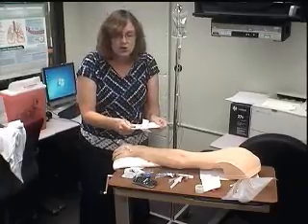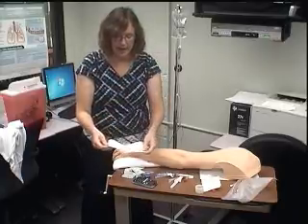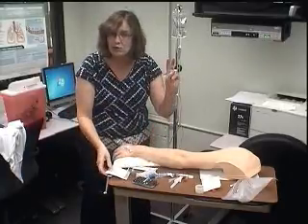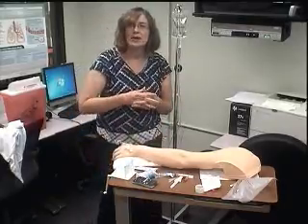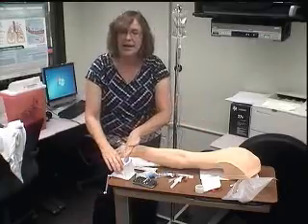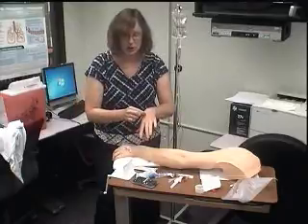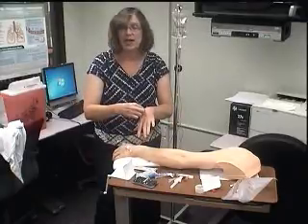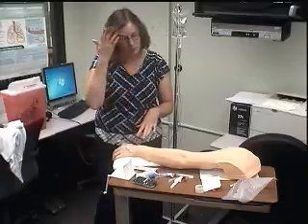2x2. Guys, just like you learn in fundamentals, when you open packages, you open using a sterile technique. I know that this is not a sterile procedure taking this out, but whenever we want to use medical asepsis, we want to stay as clean as possible. We don't want to spread germs. And if I have my hands all over this, that's going to touch the site that I pull out. There's still a little opening in the skin that's going to touch that. I do not want my germs all going, possibly invading their skin, because that's a break in the skin.